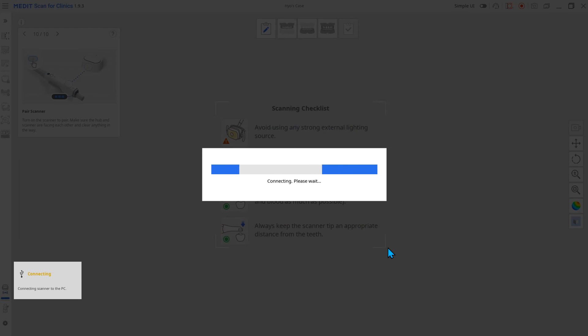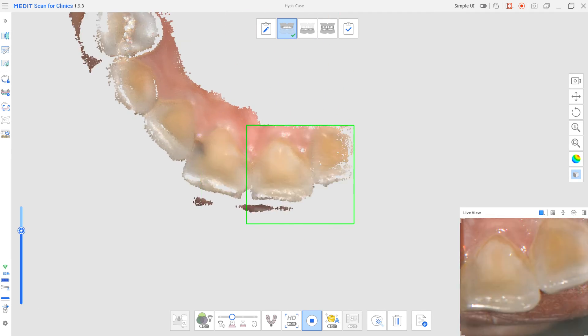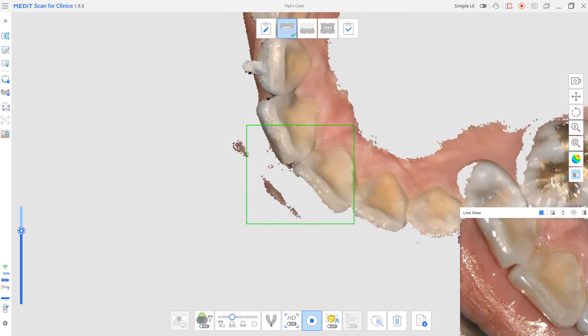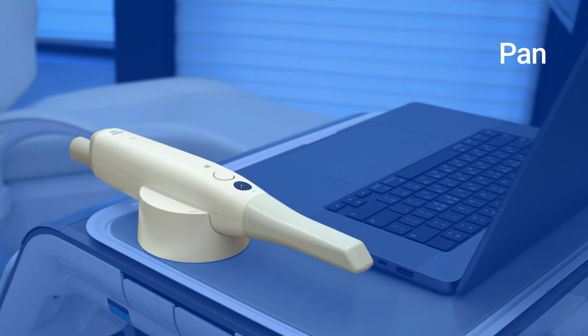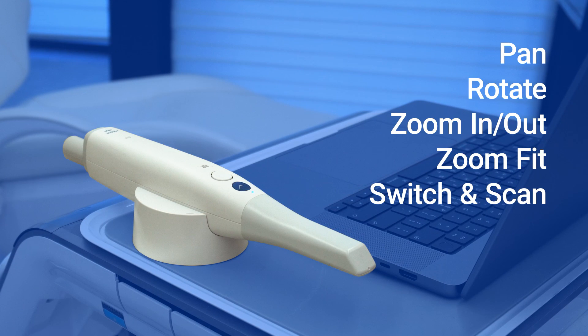When successfully connected to a wireless hub, the scanner emits a brief vibration. Launch the program and begin scanning. This is all for the various functions of the control button. Please use this function to experience more convenient scanner usability.